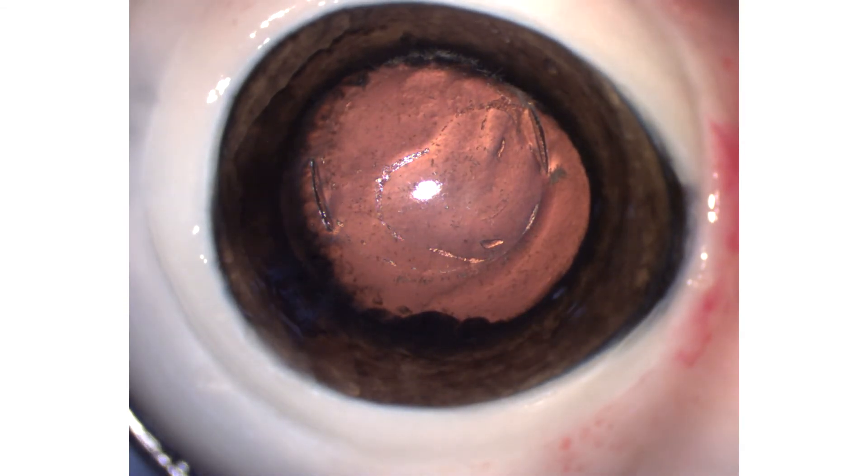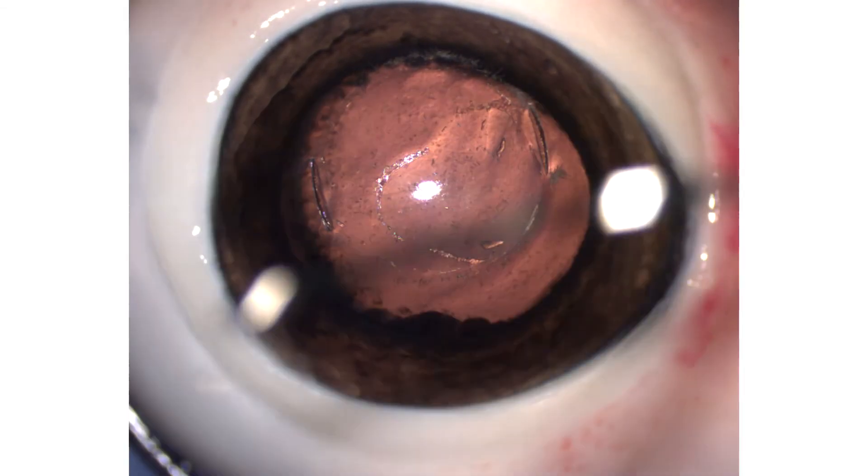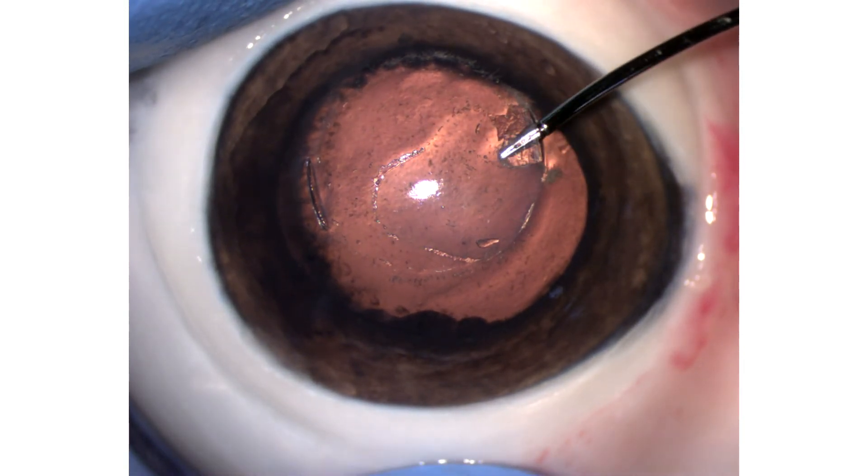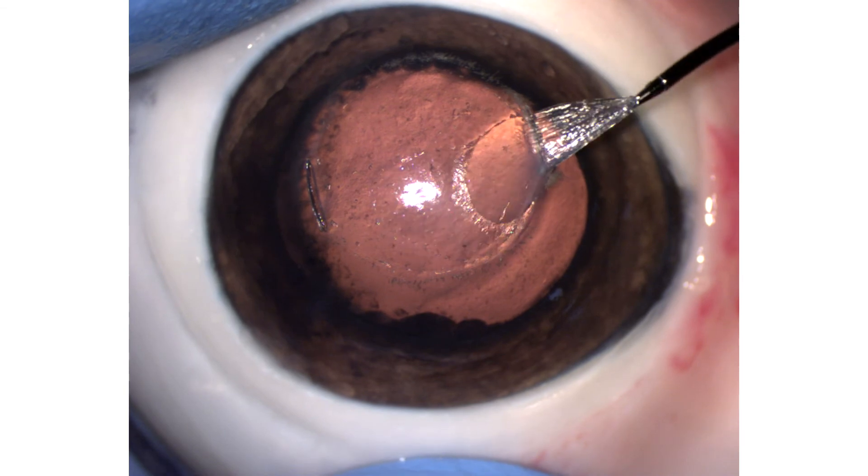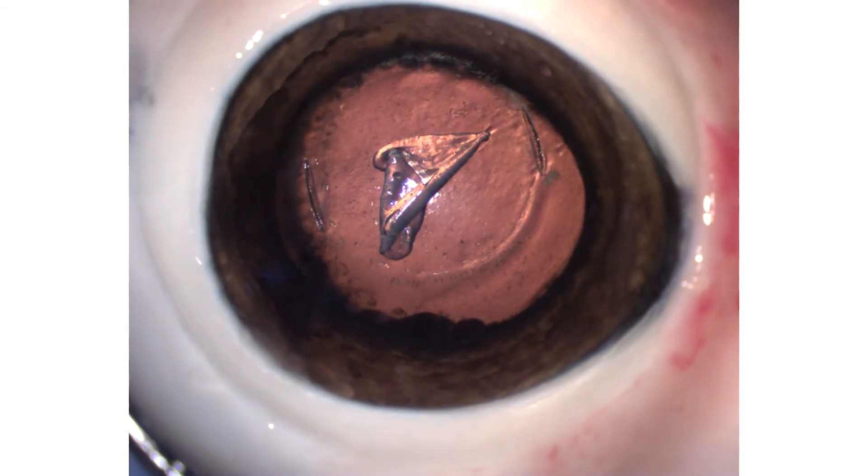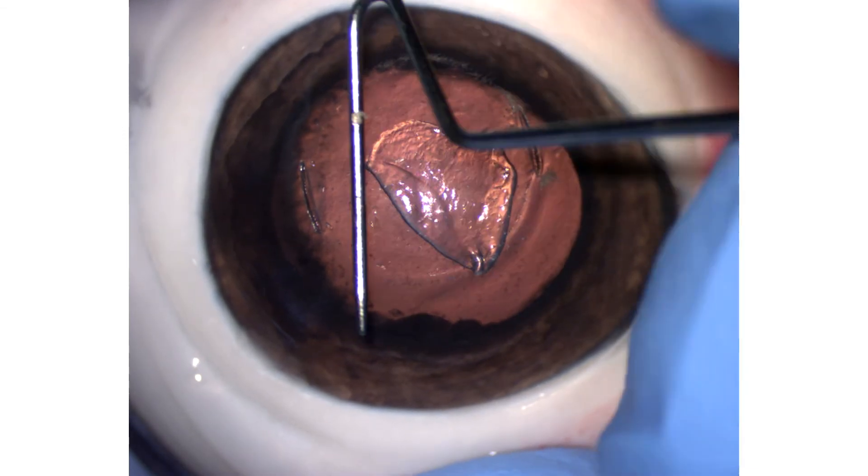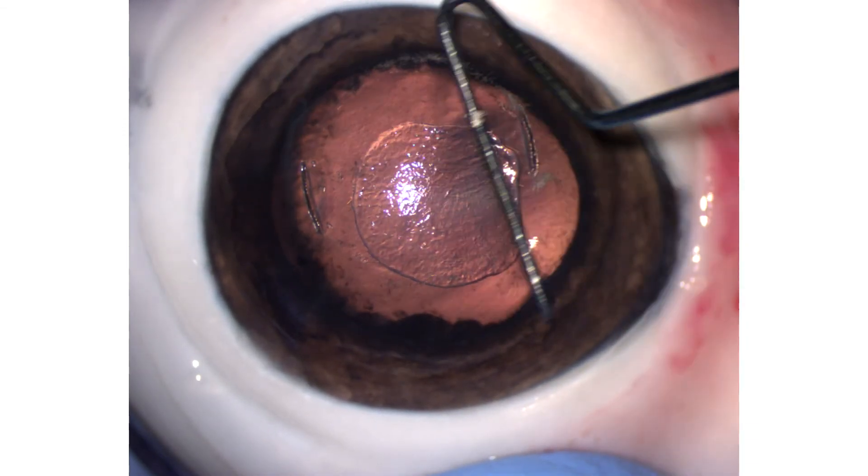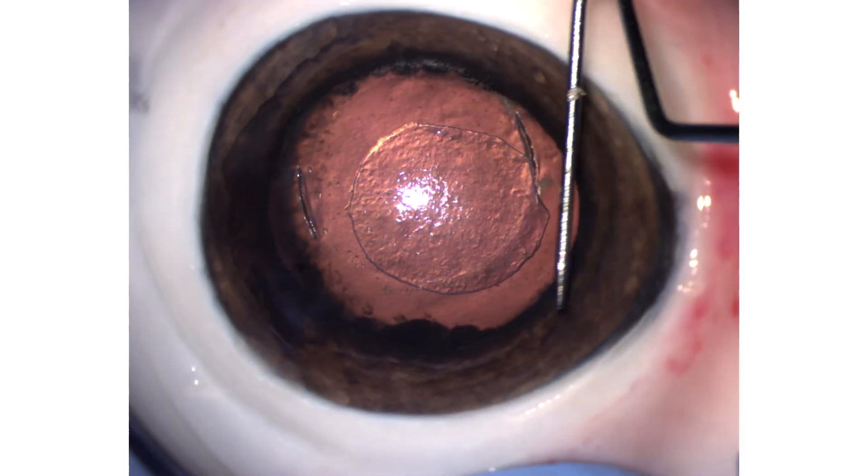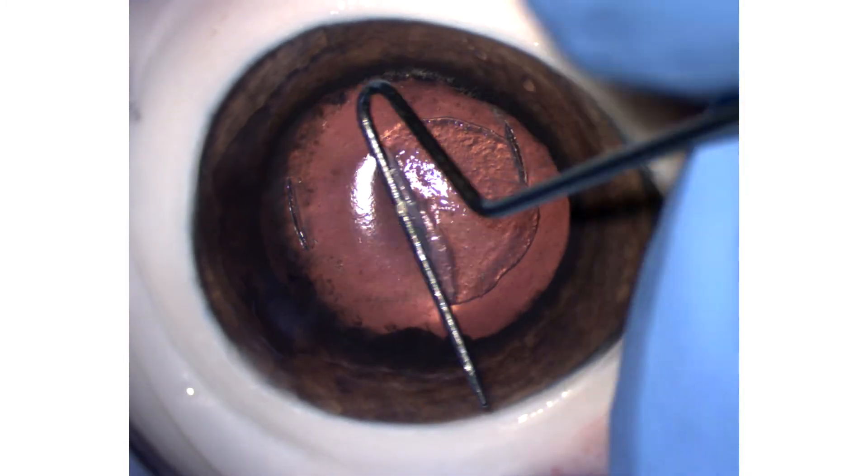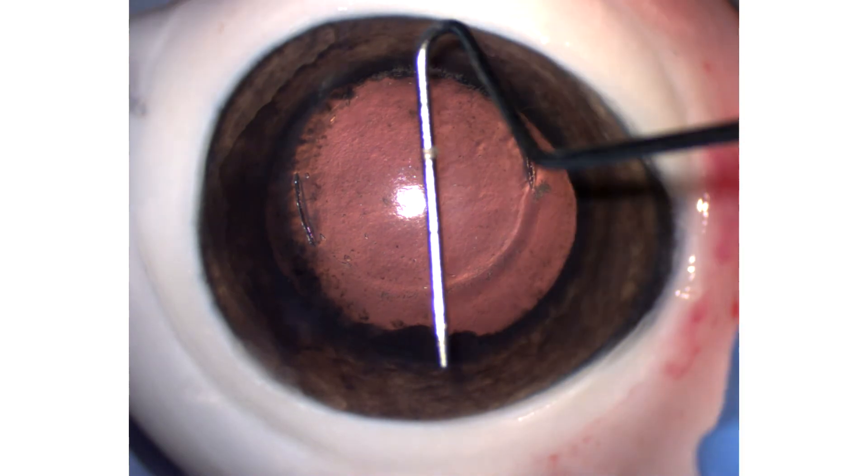And then I can come with the forceps to take the lenticle out. I can place it on the eye just to have a look if it's complete. So it's a complete lenticle. It's nice. And then I can remove it.